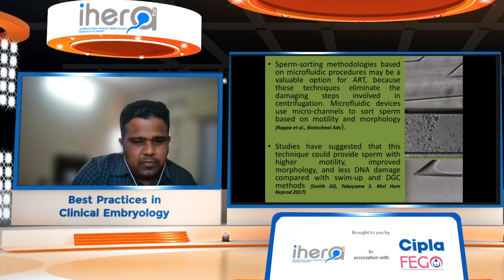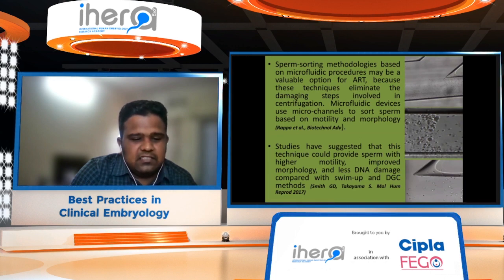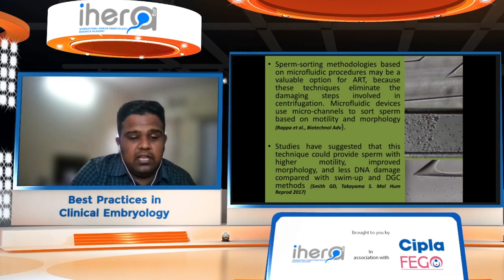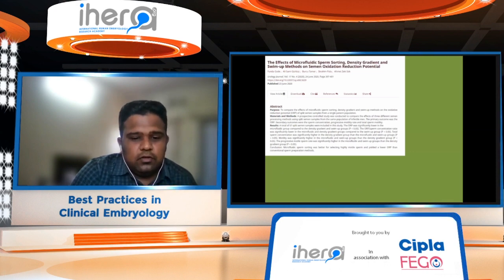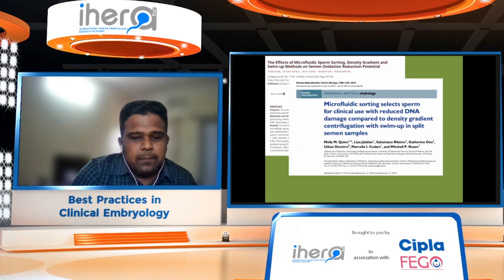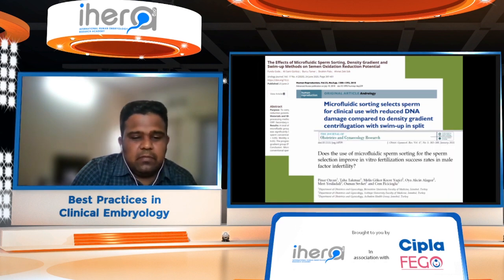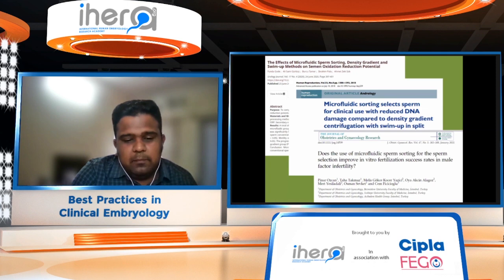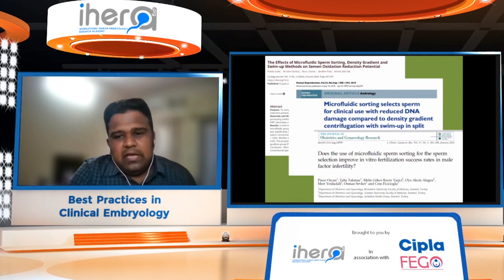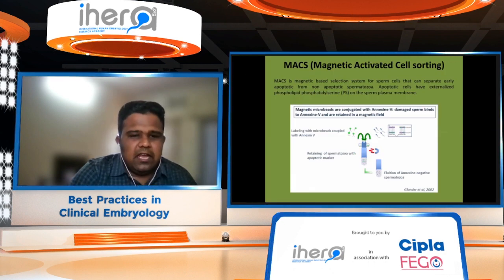Microfluidic devices use microchannels and are based on motility and morphology, and studies have suggested that this technique not only provides sperm with higher motility, improved morphology, and less DNA damage, but also has shown lower oxidation reduction potential with reduced DNA damage as compared to swim-up and density gradient methods of sperm preparation. This technique has also shown improved IVF success in severe male factor infertility. The other technique to go is MACS. Basically, it is magnetic activated cell sorting.